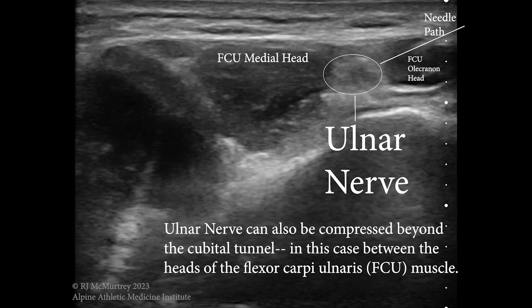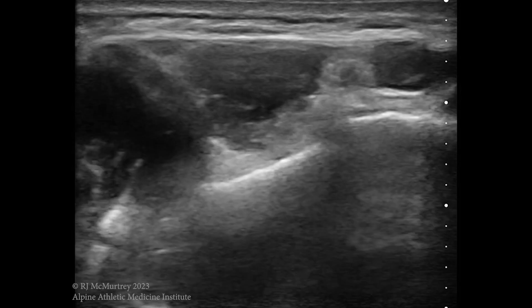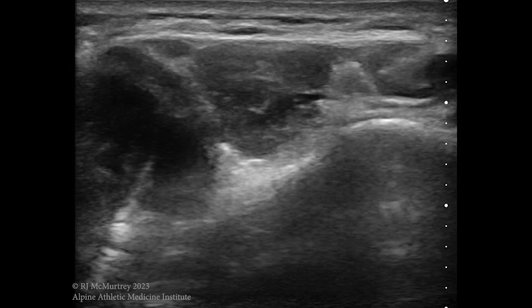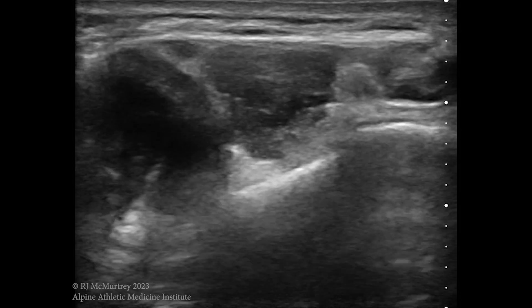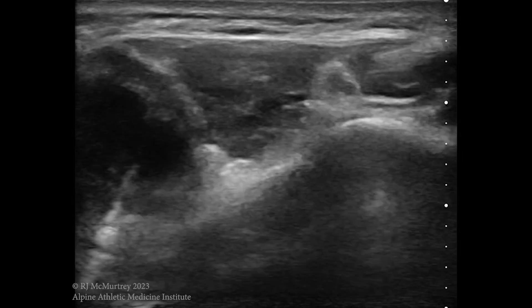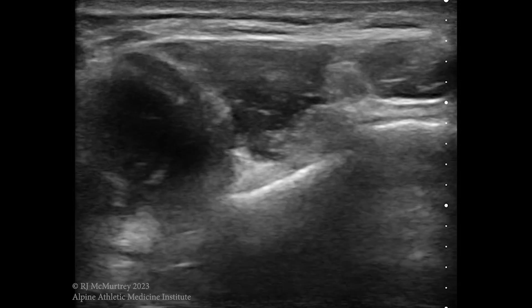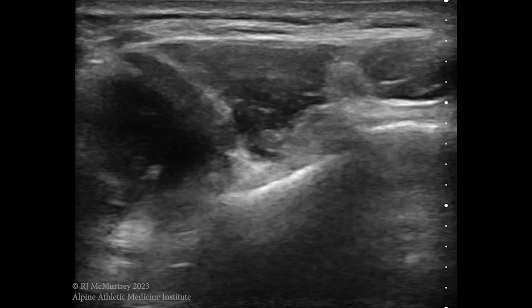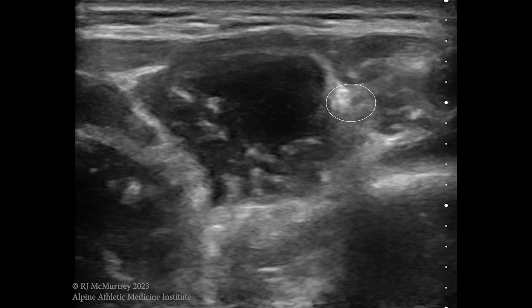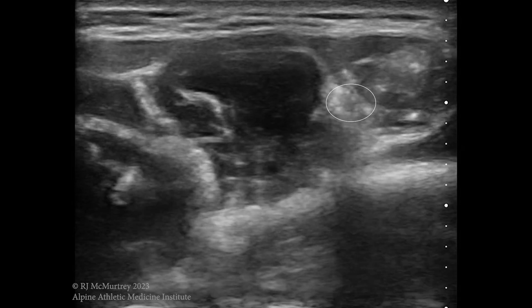In this patient, you can see between the two heads — the olecranon head and the medial head — that there is a fibrous entrapment. You can actually see the hyperechoic fibrous band around the nerve and the dilation of the nerve. I came in from the olecranon side and did a fairly shallow injection into this space to essentially hydrodissect and add more space in the intermuscular septum there.